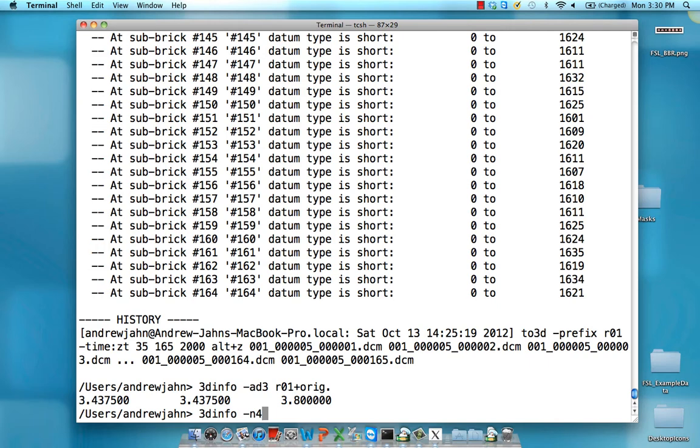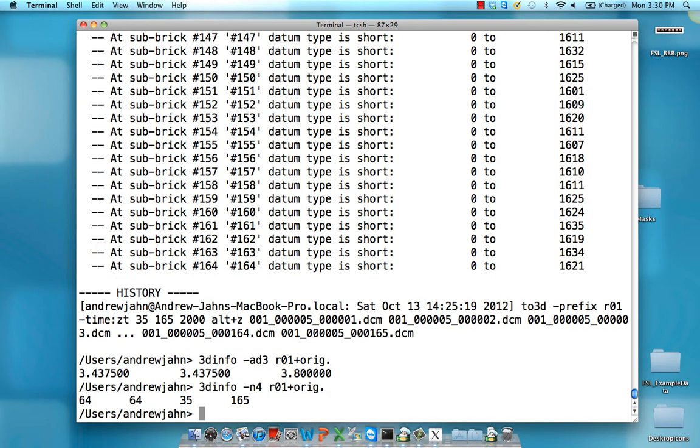Likewise, using the -n4 command will produce information about the number of voxels in the X, Y, and Z directions, followed by the number of time points.